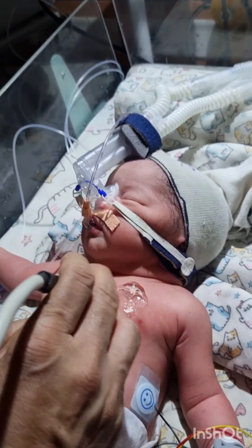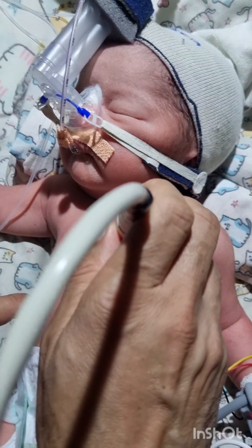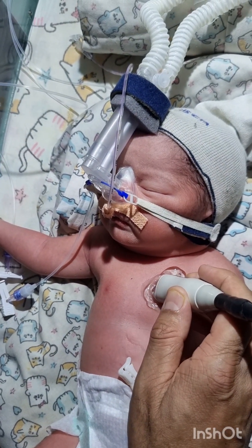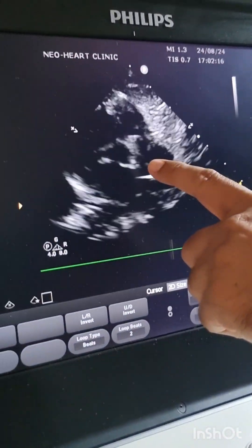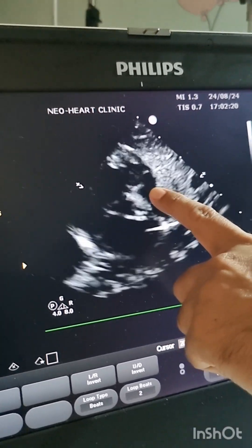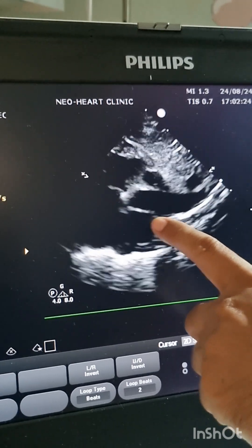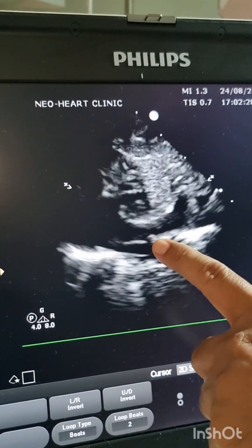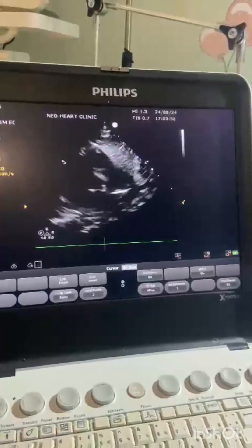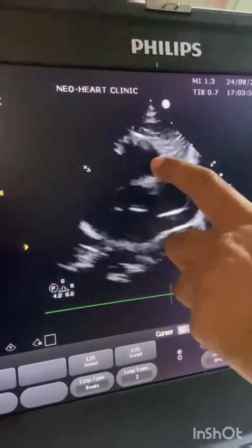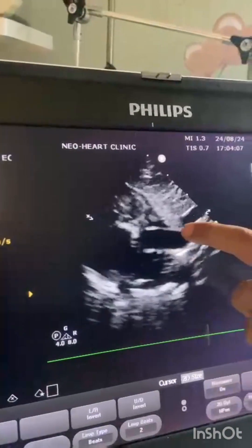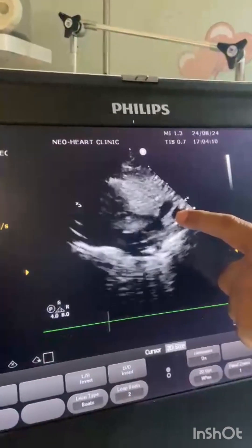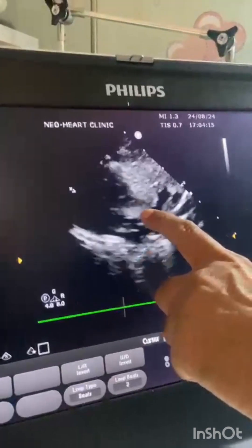I will show you the positioning of the probe again. Probe just above the nipple line, pointer pointing at 12 o'clock on the left side of the sternum, and sweep towards the right of the baby. When you keep the probe on the left side of the sternum you will see the pulmonary artery and aorta in cross section. Sweep right and you start seeing the aorta in longitudinal section, and when you sweep more right you will start seeing the SVC entering into the right atrium.